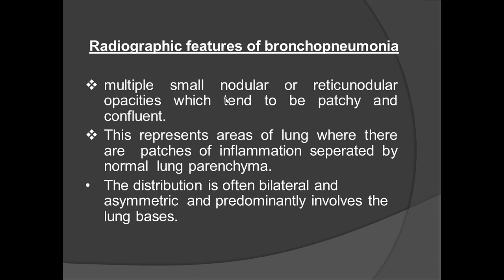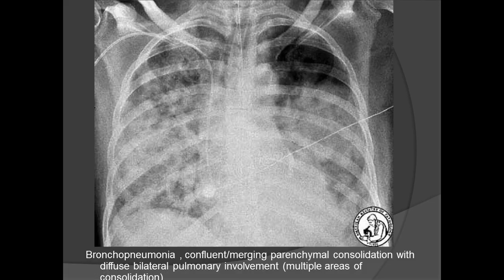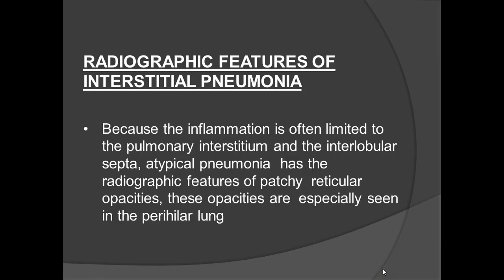Radiographic features of bronchopneumonia include multiple small nodular and reticulonodular opacities that tend to be patchy and confluent, representing patches of inflammation separated by normal lung parenchyma. A classic example shows bilateral non-segmental consolidation in the lingula and right upper lobe perihilar region with linear and nodular shadows — this is bronchopneumonia, most commonly seen in viral and some bacterial infections.